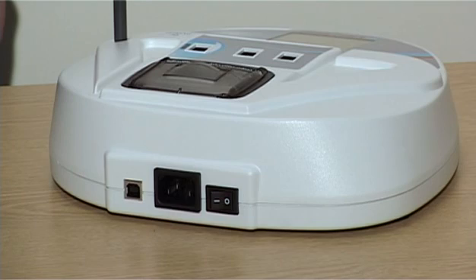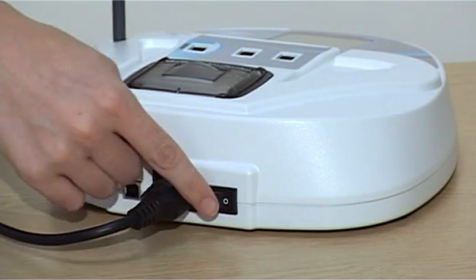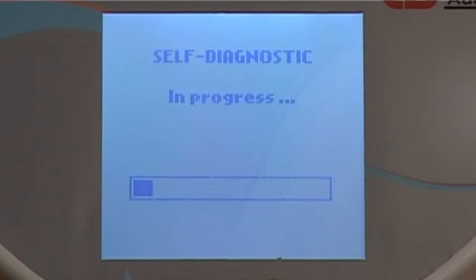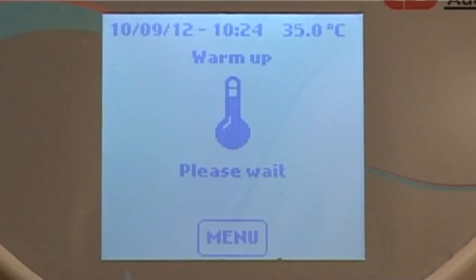To start the analyzer, plug in the power supply on the rear of the panel and press the on button. The instrument performs a self-diagnostic test. Press OK at the end of this test. The instrument will then enter a warm-up phase to bring it to 37 degrees Celsius, which will take between 10 and 15 minutes.